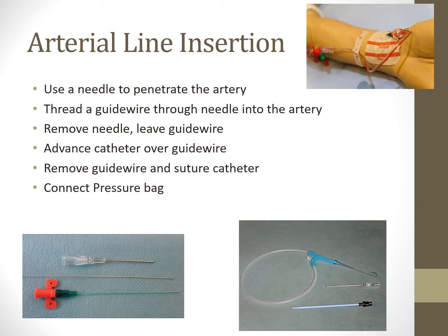Insertion techniques, there's a couple of different techniques that are out there, so just be aware of whichever one your hospital desires to use. So you may be inserting arterial lines, depends which hospital you work at. Hopefully all hospitals down the road have good, well-trained RTs that are performing this procedure. So some of them use the needle to penetrate the artery, sort of like running a blood gas, and then you're going to use a guide wire through the needle into the artery.